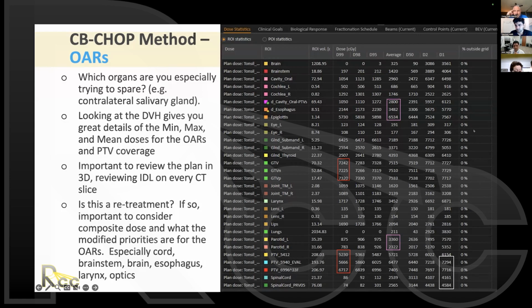One quick comment I want to jump on before we go ahead is from Ana Peña about re-irradiation and possibly treating with different fractionations and how to evaluate the organ at risk doses. So this is where you really want to try to get access to the initial radiation plan if it wasn't at your center. You want to ask for all of the isodose lines to be overlaid in a deformable registration.